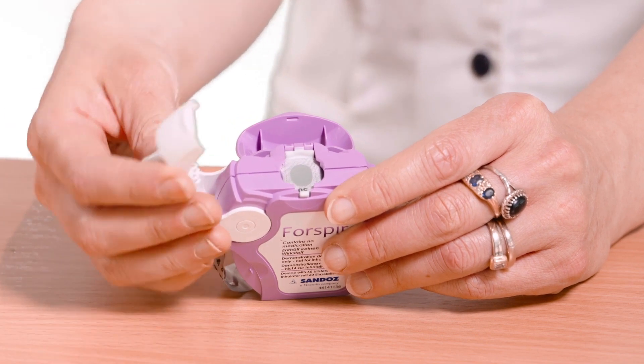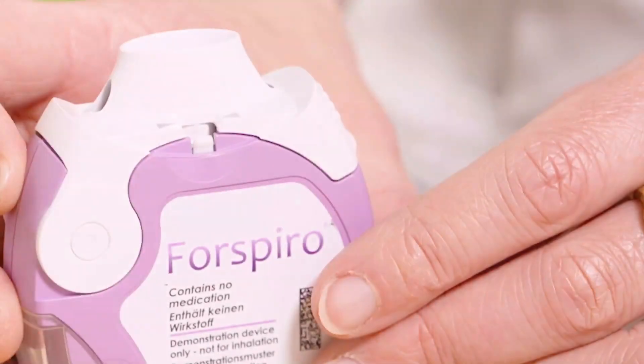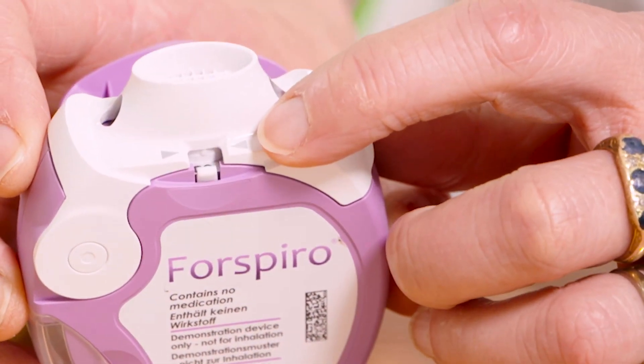Gently press the cap down until a click sound is heard and the cap is fully closed. The arrow on the cap must be fully lined up with the counter.